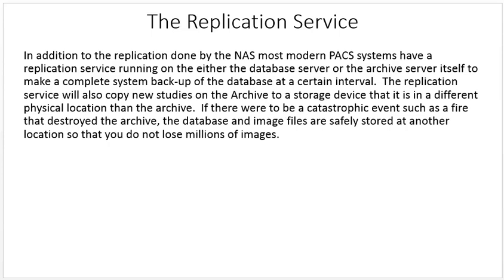So, database backups, very important. Something you'll need to check every day as a PACS admin. Typically, you'll run something called an incremental. So, on Monday, you'll run an incremental, and that backs up everything new in the archive from Sunday at midnight to Monday at midnight. So technically it runs first thing Tuesday morning, right? So every day of the week, you're going to run an incremental, which basically backs up the last 24 hours.